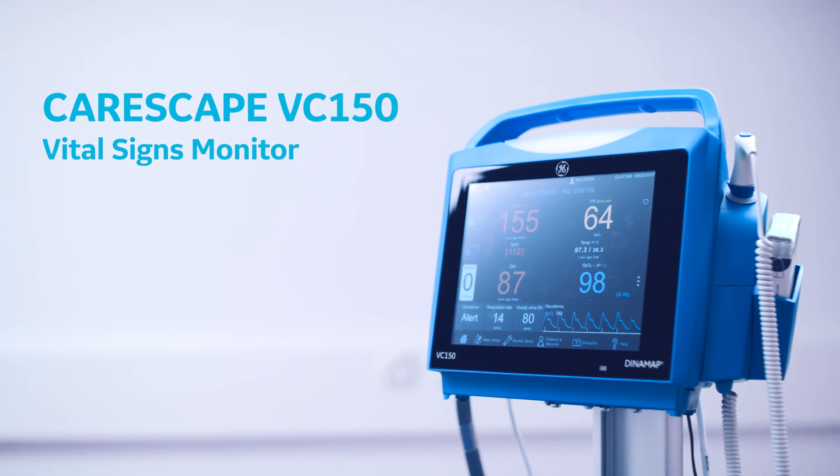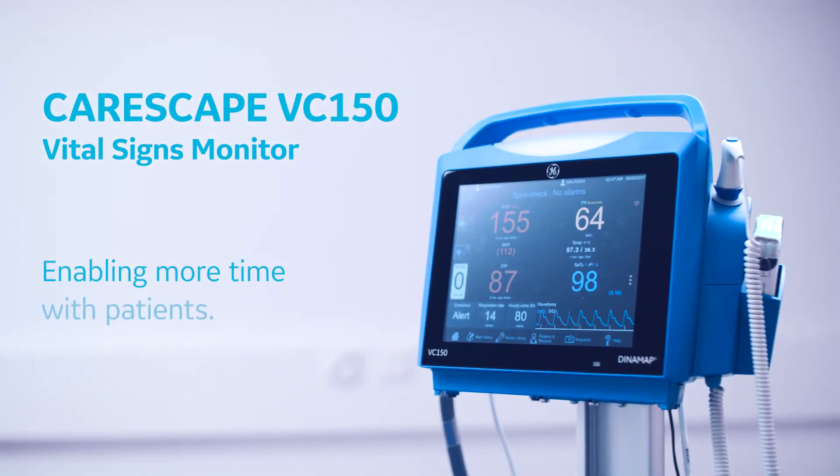CareScape VC 150 Vital Signs Monitor. Enabling more time with patients.